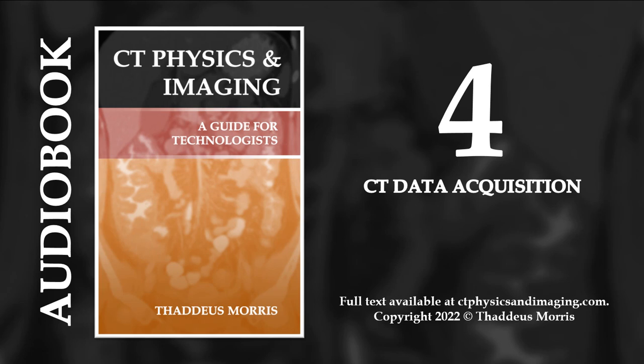Field of view. There are 2 fields of view in CT. The scan field of view, that's the SFOV, and the display field of view, the DFOV. The scan field of view, or SFOV, refers to the entire area inside the scanner that is actually being scanned. The display field of view, or DFOV, refers to just the area that is processed for viewing.